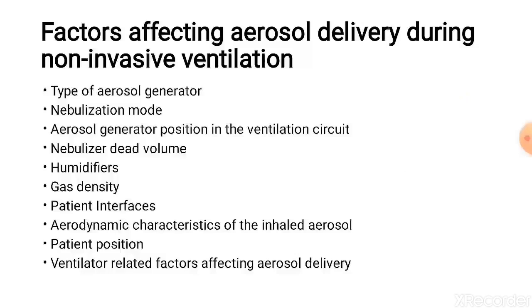Factors affecting aerosol delivery during non-invasive ventilation are type of aerosol generator, nebulizer mode, aerosol generator position within the ventilation circuit, nebulizer dead volume, humidifier, gas density used, patient interface, aerodynamic characteristics of the inhaled aerosol, patient position, and ventilator related factors.